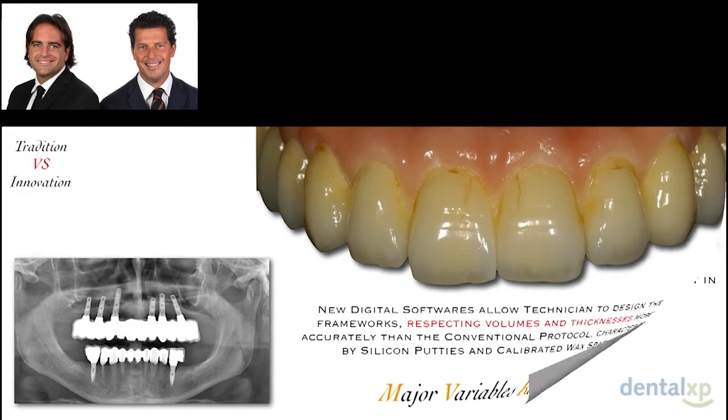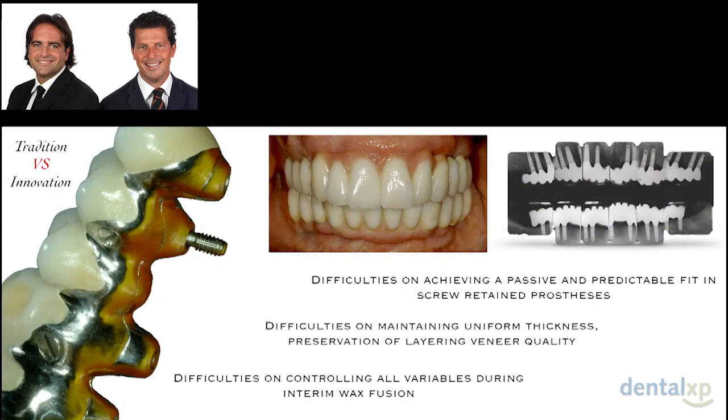This variable reduction permitted a standardization of the procedures, leading to a predictability not obtainable before without a very talented and skilled dental technician, like in this case restored in 2003. And this revolution also brought a faster workflow production, decreasing the difficulties in achieving passive fits.